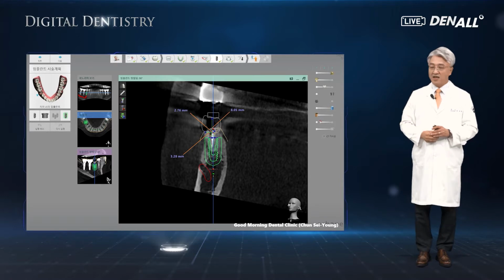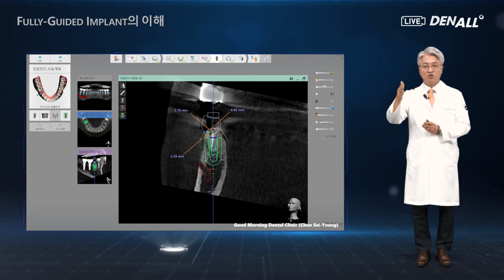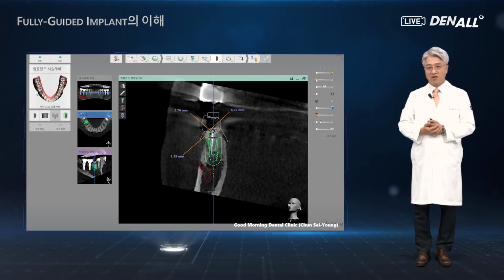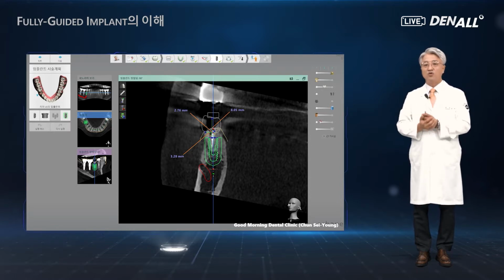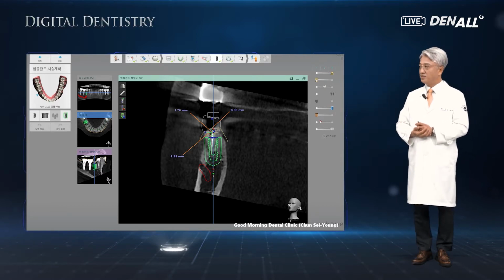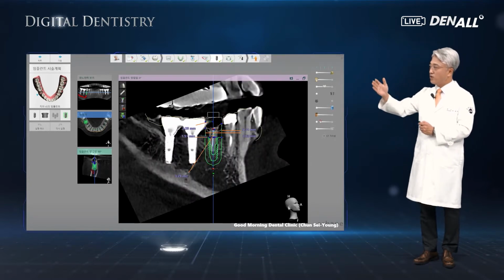As you can see, figures and the heights are measured, considering abutment shape and gingiva shape that we want. If they can be reproduced given the figures and heights in terms of the length and width to determine implant positions, final decisions including prosthesis is made by measuring these lengths during the planning process.